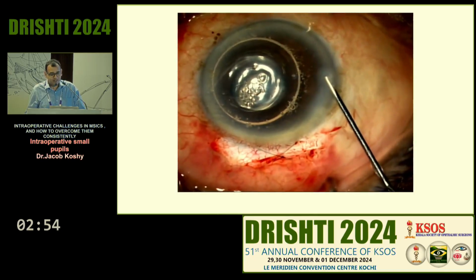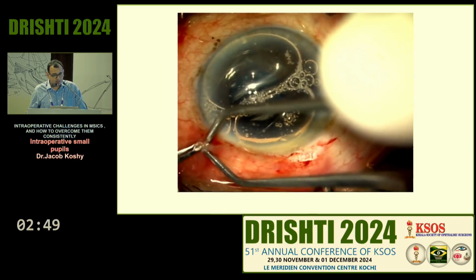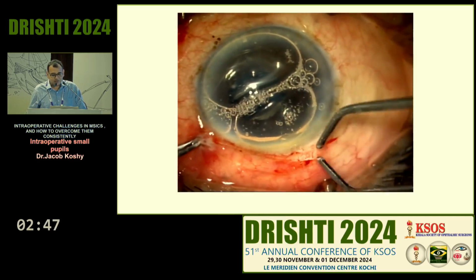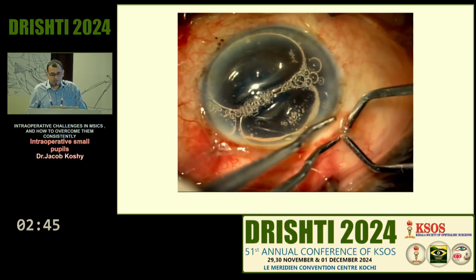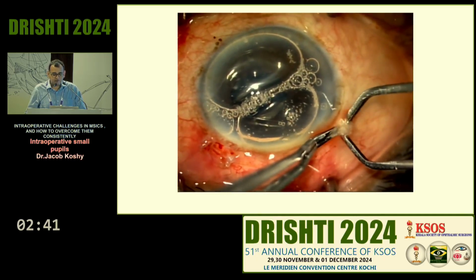And yeah, that's how I would try and manage an anterior case where the posterior capsule is ruptured with vitreous loss. Sometimes it's not always this smooth, and remember that if you can't manage it, just ask for help. That is more important than trying to be a hero in these situations.